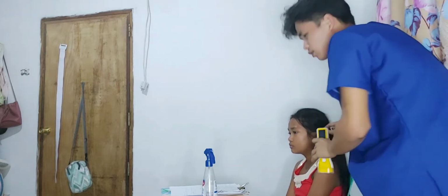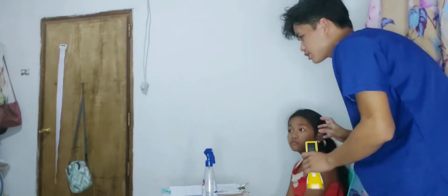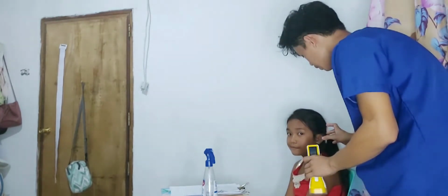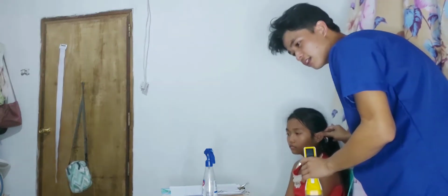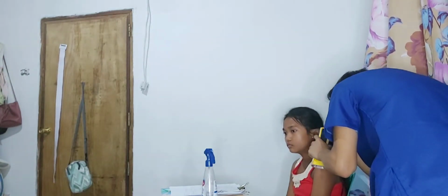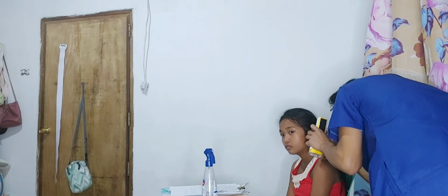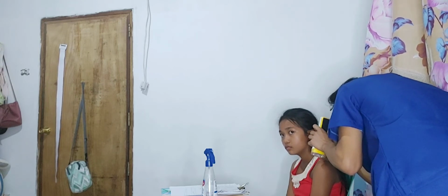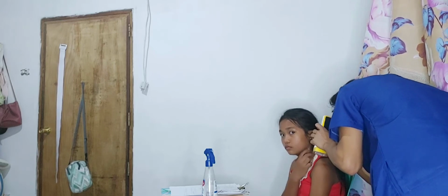And also, we're going to observe or inspect the canal walls. So check for any color, size, and consistency, and observe for any consistency or discolorations of cerumen. So yung kabila naman.